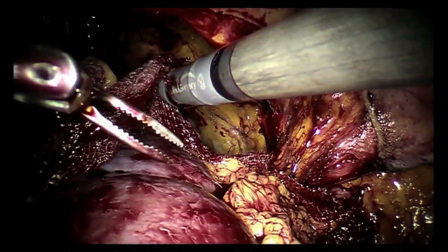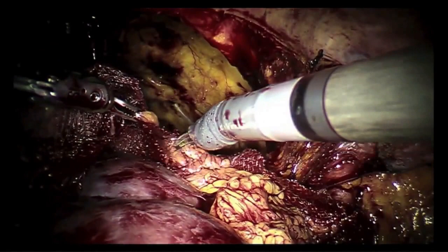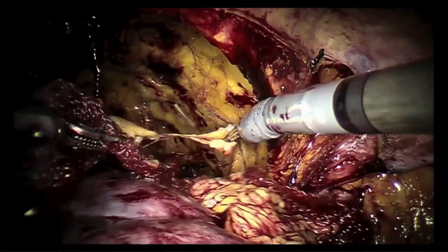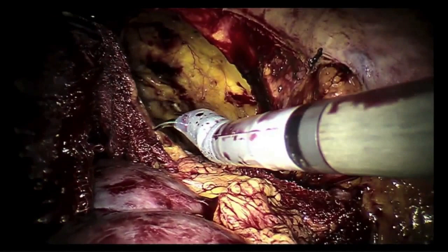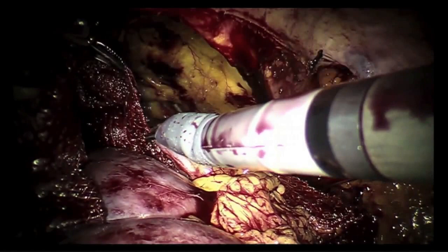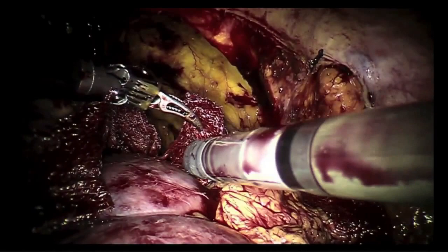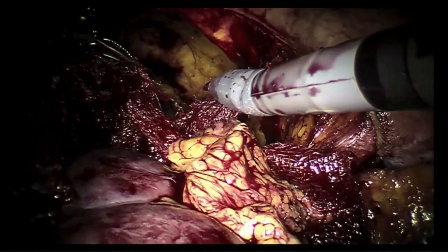We should put some warm water on this kidney to make it look happier. Although it's looking pretty happy now. So normally, I go right-hand suturing outside in on the iliac artery. That's easier to do, but obviously if there's plaque disease, then you cannot do that. That's why today we've switched to left-hand suturing. Chief, there has to be a better way to get rid of this stuff.